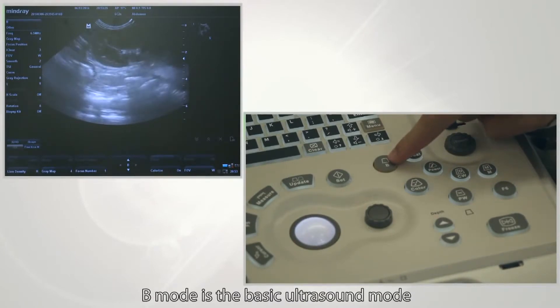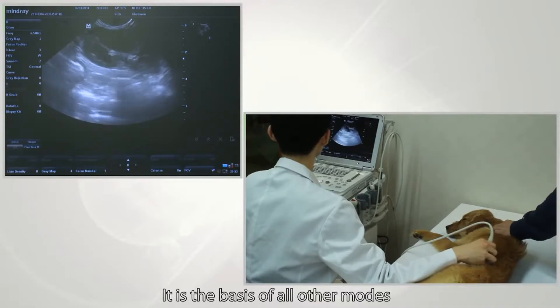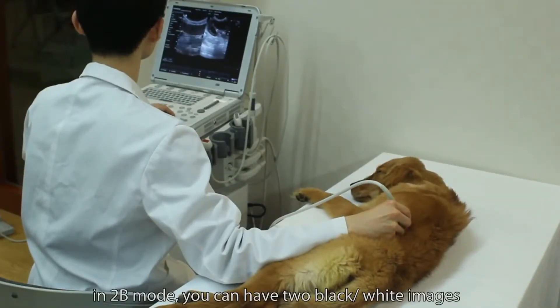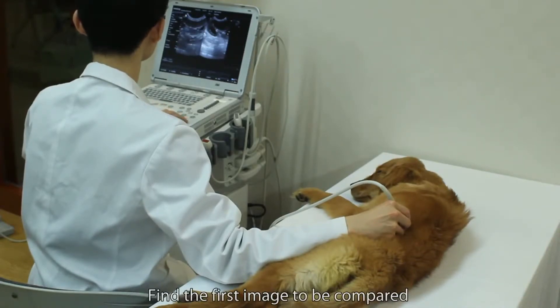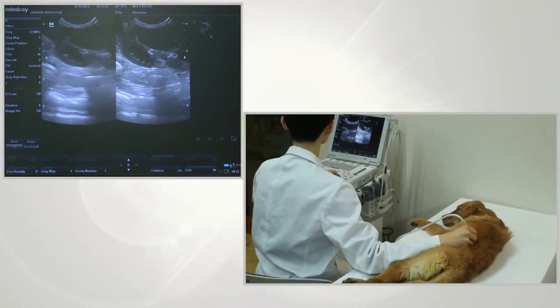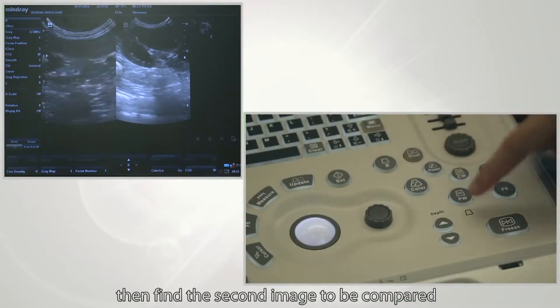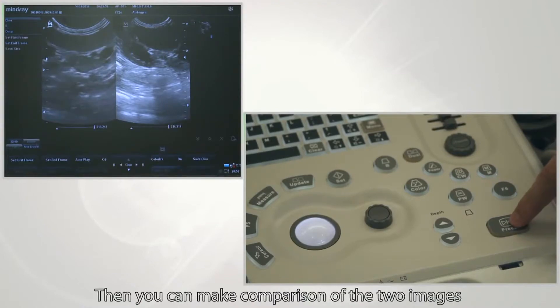B mode is a basic ultrasound mode and is the basis for all other ultrasound modes. In 2B mode, you can have two black-and-white images side by side for comparison. Find the first image to be compared and click dual to freeze it. Then find the second image to be compared, press freeze to free it, and you can then compare the two images.